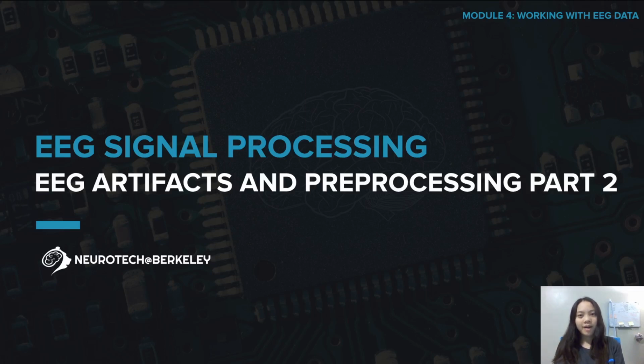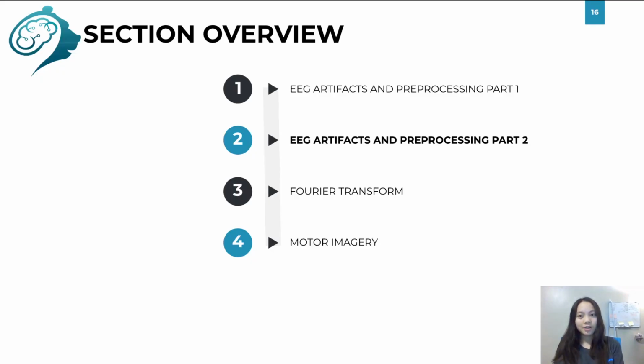Hello, welcome back to Module 4, Working with EEG Data. In this lesson, we're going to cover EEG artifacts and preprocessing, Part 2.